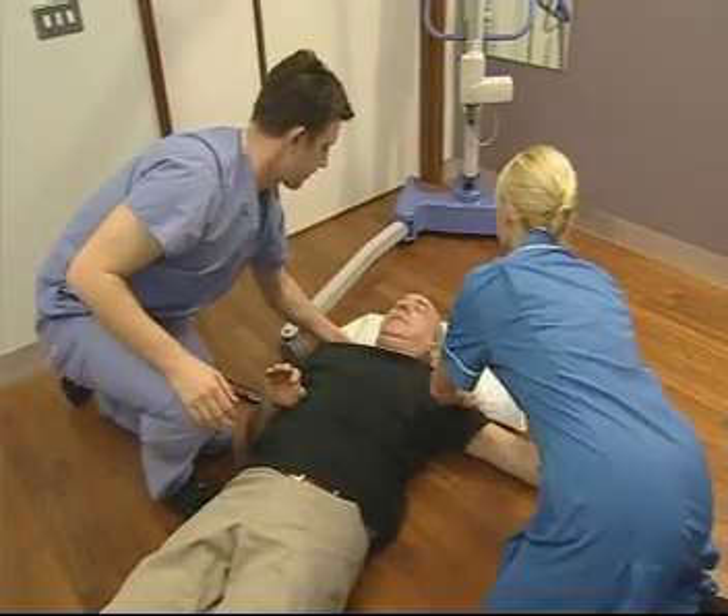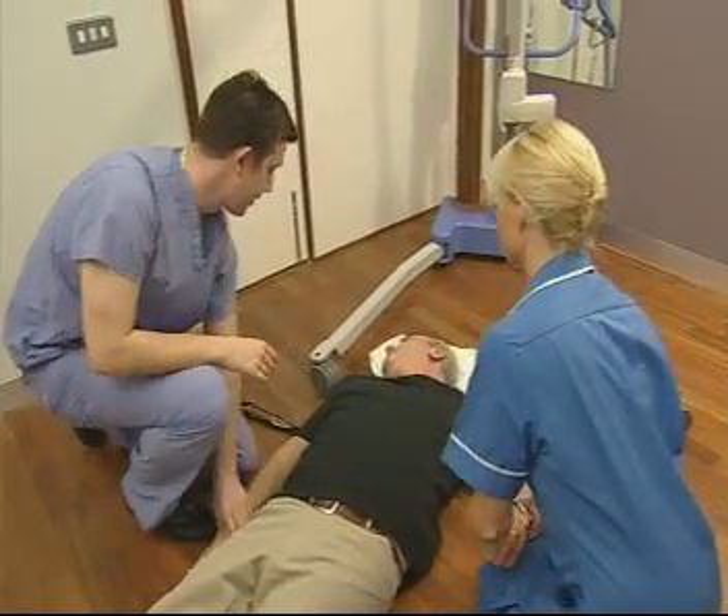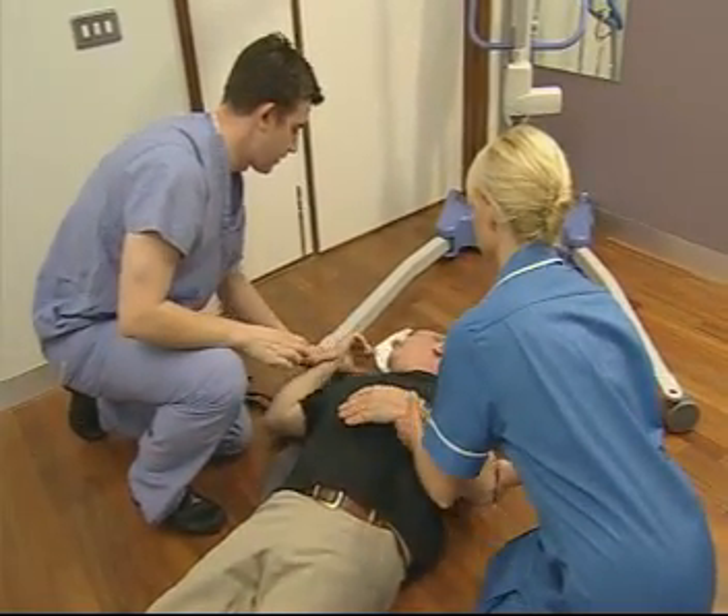Roll the patient gently to the other side, repositioning the pillow if necessary, so the second carer can pull the rest of the sling through easily.